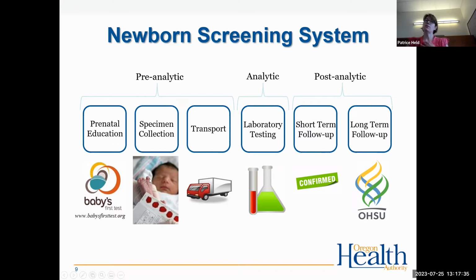Typically, the specimen collection is performed by hospitals, nurses or phlebotomists, or performed by midwives who are delivering out-of-hospital births. We need to have timely transport of the specimen from the point of collection to the laboratory, the public health laboratory. And of course, we need to do our testing well and report results in a timely manner.